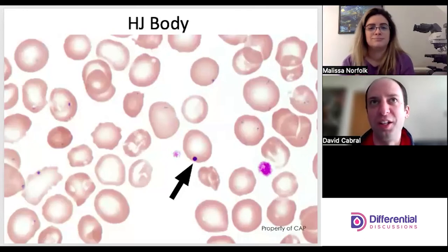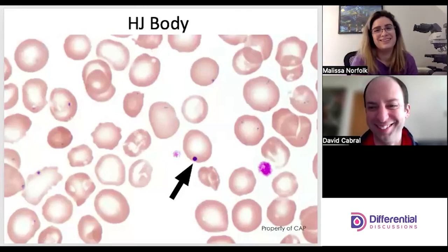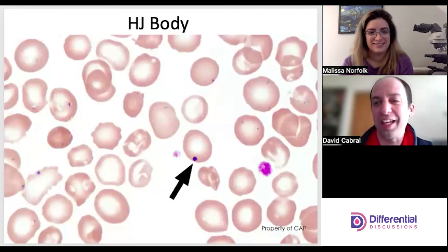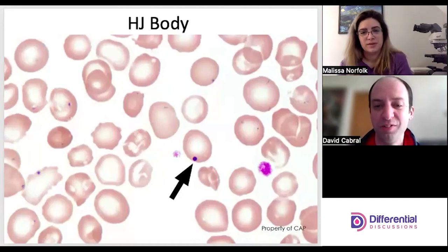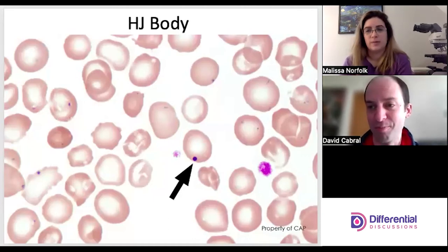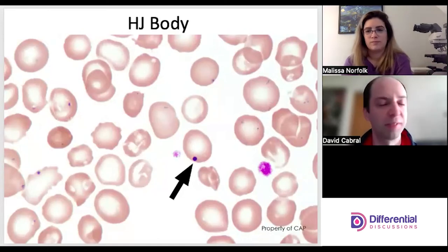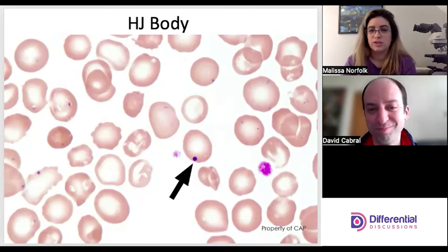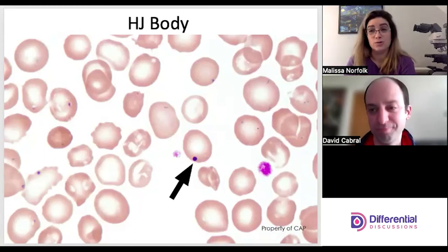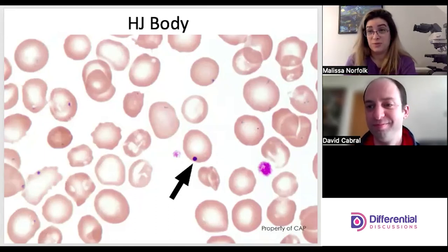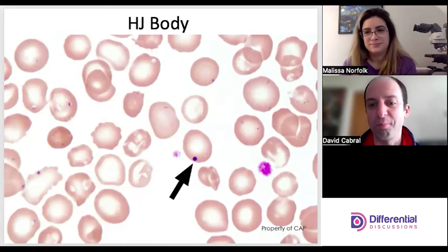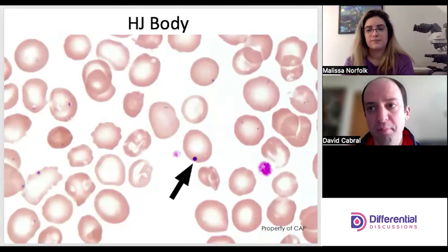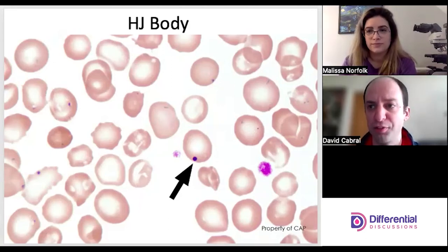Howell-Jolly bodies — these are one of the easier inclusions to distinguish. The Howell-Jolly body represents a fragment of DNA. Usually there's only one, occasionally two in a cell. You don't really need to play with the fine tune because they're usually prominent. They're typically very round and smooth — like a perfect sphere or circle.